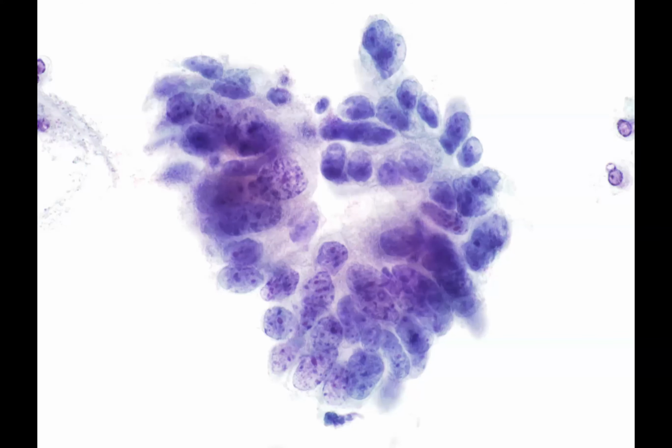This is a different sample. This is slightly different staining, and depending on the lab you work in, you might see a slight variation in Pap stains. But what you can appreciate here is, again, the supercrowded nature of these glandular groups, a gland opening here. I also really want you to appreciate this abnormal chromatin pattern. These are not vesicular euchromatic nuclei. You can see the coarse granular appearance to this abnormal chromatin.